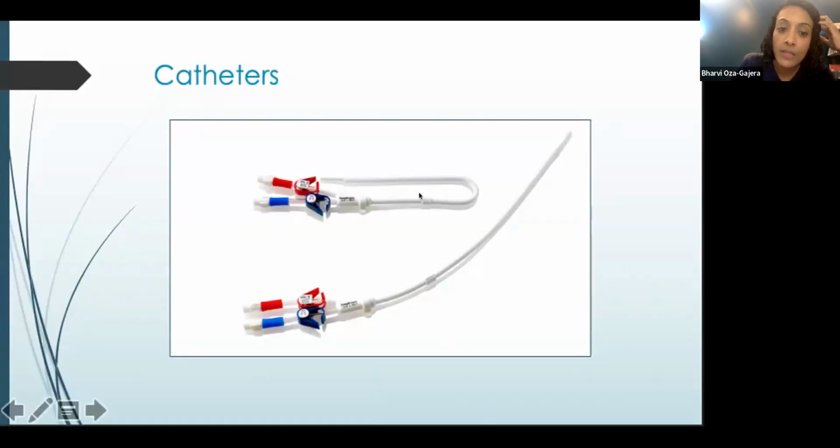entire catheter in place. So when it is inserted, that cuff is 2 to 3 centimeters higher than the exit site. So higher than where you see that catheter coming out. That's where that cuff is. And that cuff is what holds the whole catheter in place. But also that cuff is what keeps that entire catheter sort of clean and relatively sterile from here all the way back to the bloodstream. So it creates a barrier to all the flora from the outside.